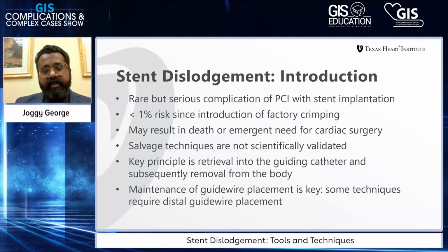Maintenance of guide wire placement is key. As we discussed, most of the techniques that we rely upon depend on the guide wire placement, which is key to getting the dislodged stent out.